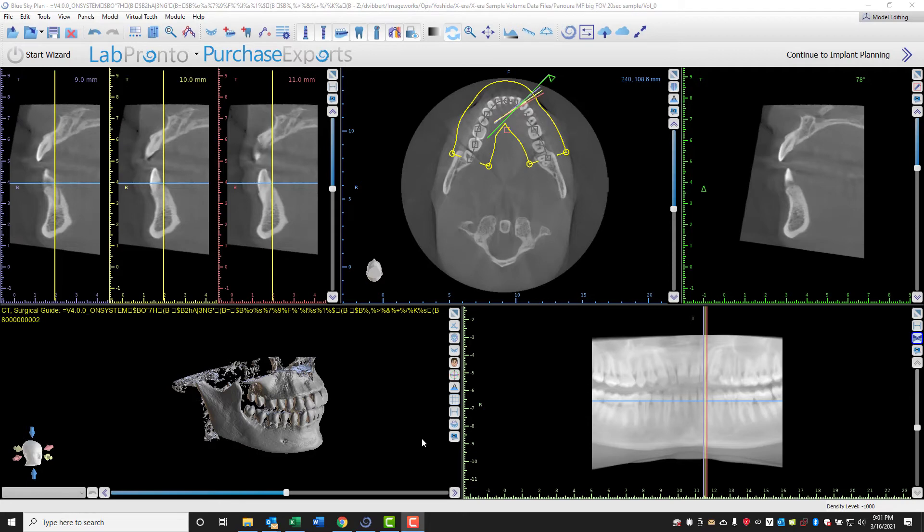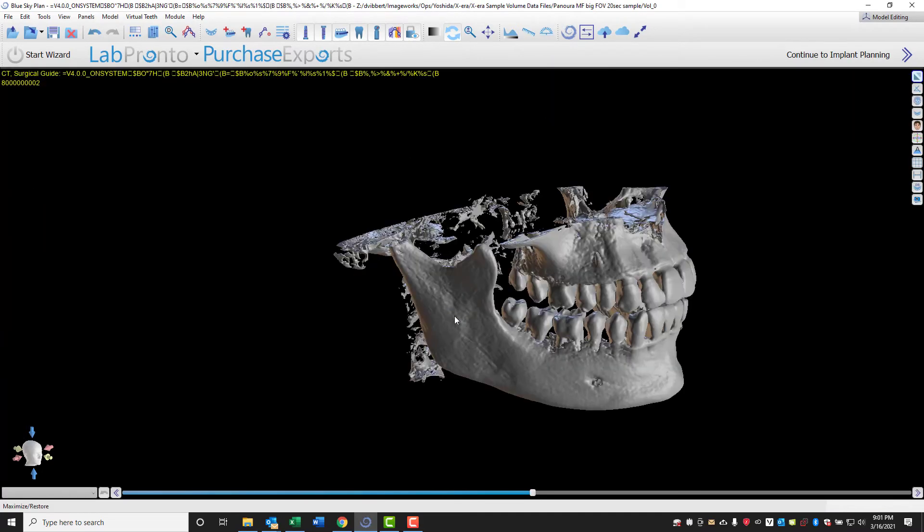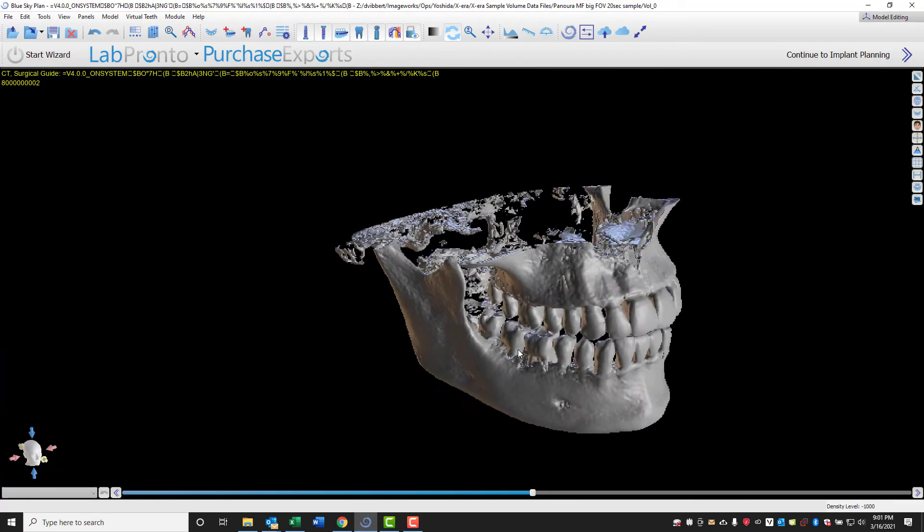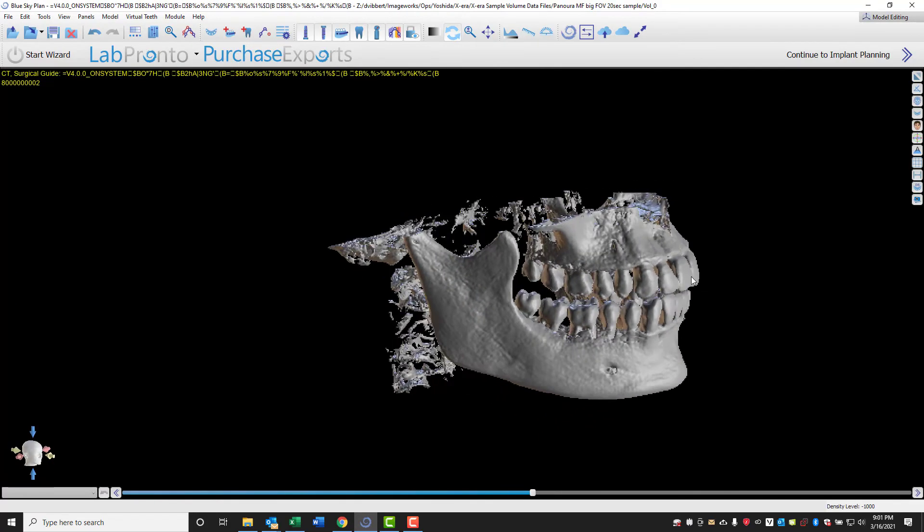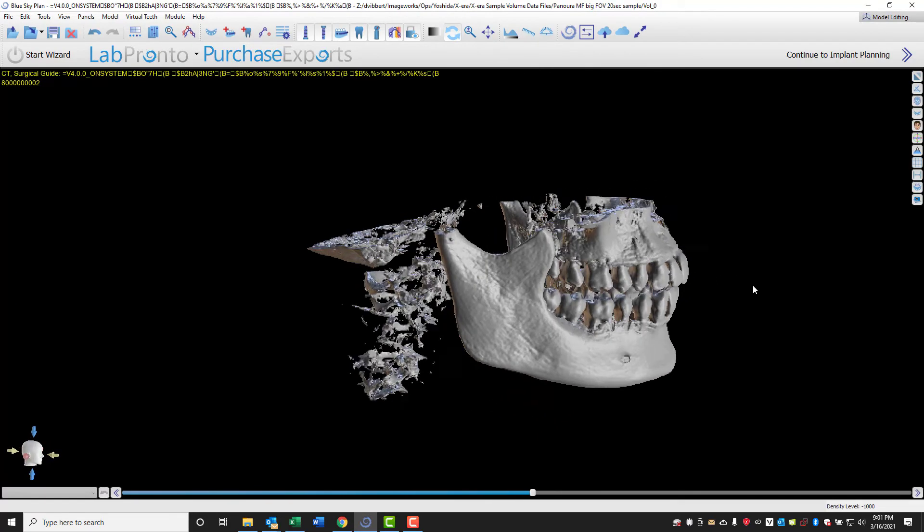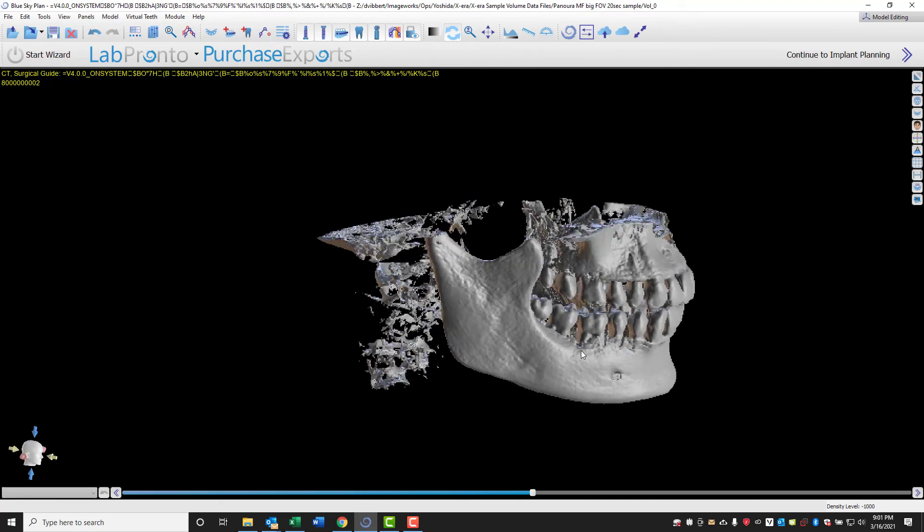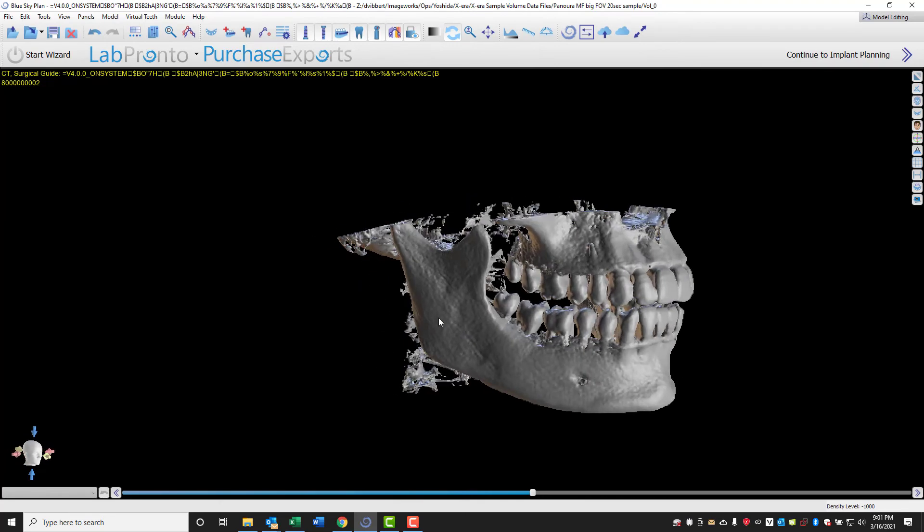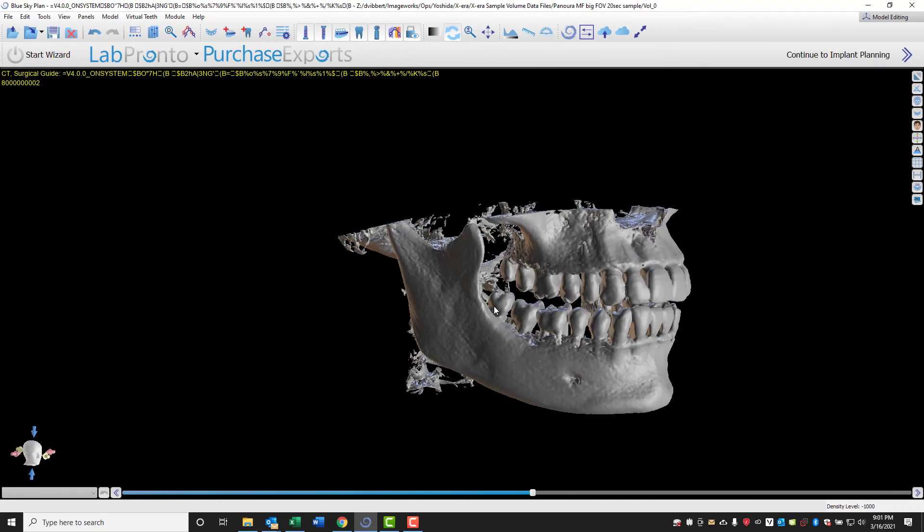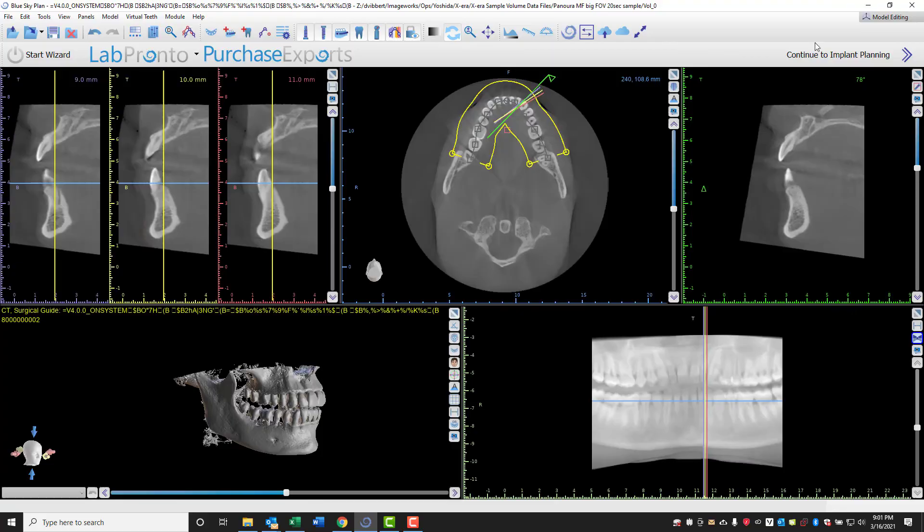And voila, our volume is now in Blue Sky Bio. Now that the volume is in the design software, you can merge it with your intraoral scanner data file or a digital impression scan. And of course, from here, you can do a full design of your surgical guides.